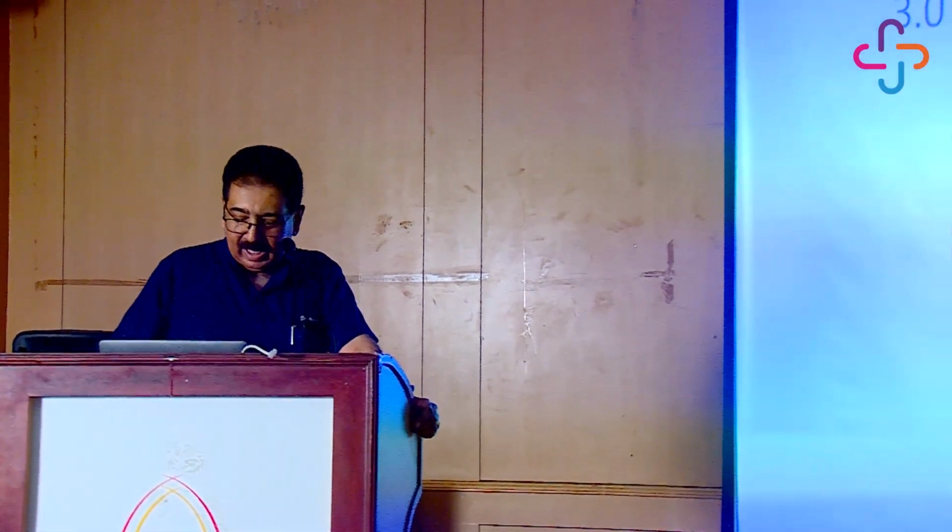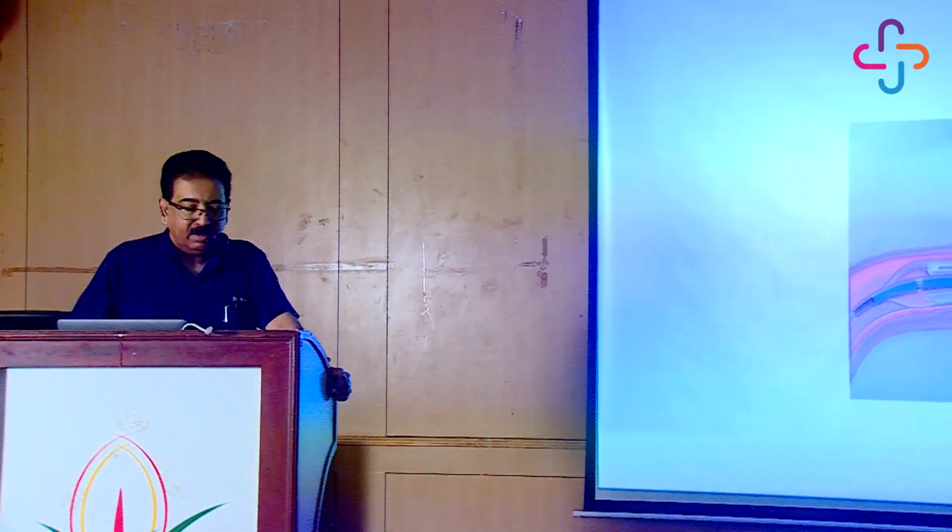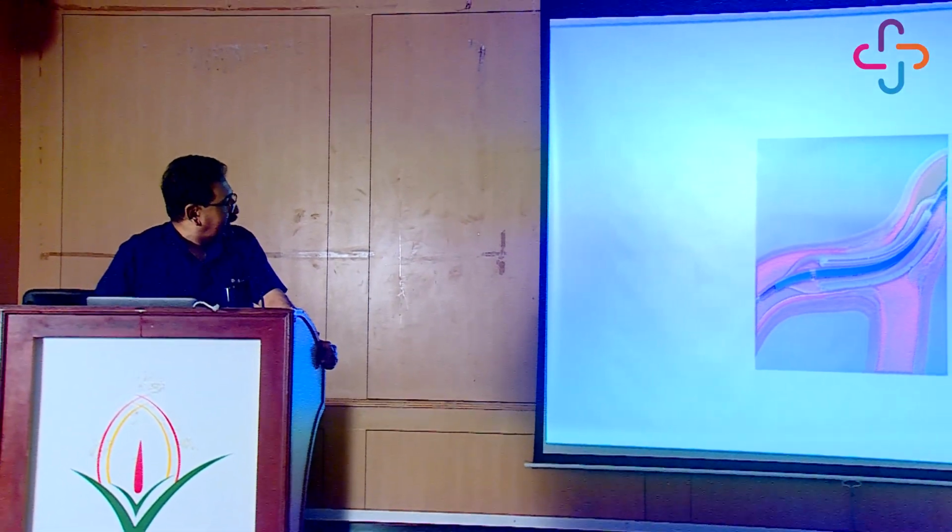This was an 84-year-old lady who had chest pain with ST depression. Troponin was positive, had good LV function. She had previously been treated at Mount Sinai Hospital where she had angioplasty to left main, LAD and LCX, and imaging, rotablation, etc. was used during the index procedure. And then we use a cutting balloon. A cutting balloon has blades in the balloon which helps to open and create cuts in the calcium, thereby aiding stent deployment.